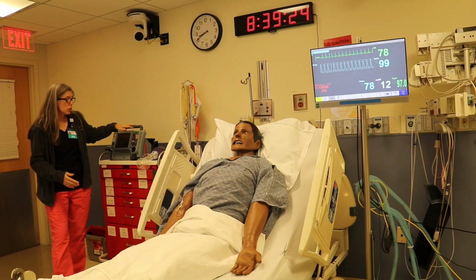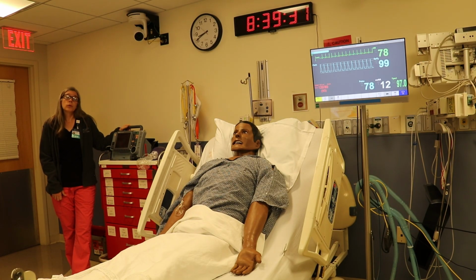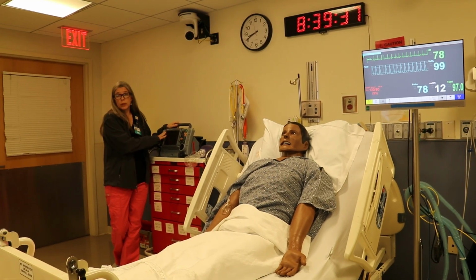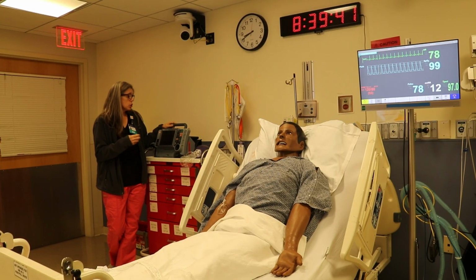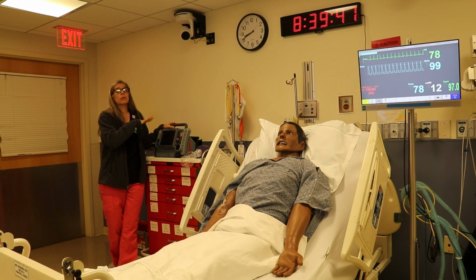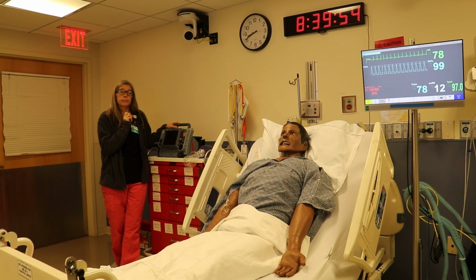This is a simulated code cart similar to what you would find in your clinical practice setting. It also contains a defibrillator. If your scenario requires the use of a defibrillator, please remember that this is a live defibrillator, and in order to use it, you want to do so safely, making sure that if you're going to deliver energy and push shock, that you do what you would do in a clinical environment and make sure everyone is all clear from the patient, the bed, and any equipment touching the bed before you push shock or you will harm someone.